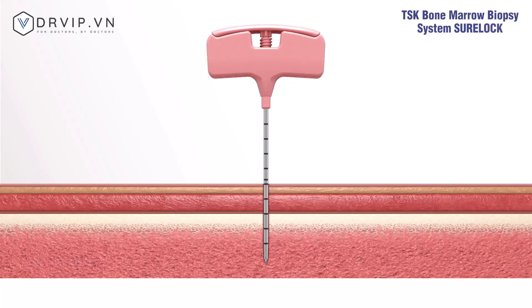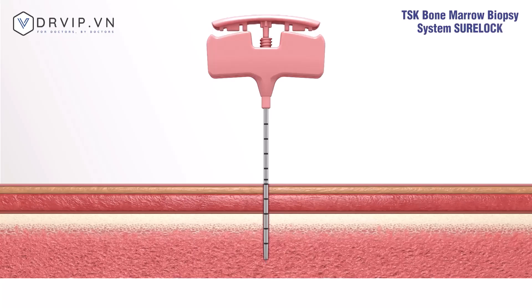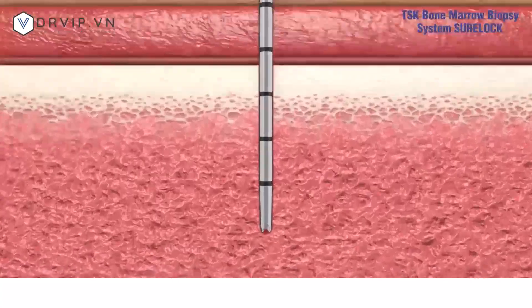After reaching the bone marrow cavity, pull the stylet straight out. Gradually push the outer needle handle with large left and right rotations to collect tissue into the outer needle.